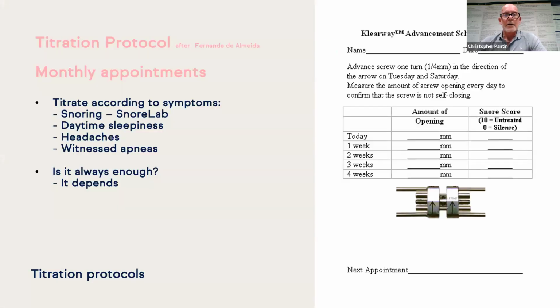All right. So this is looking at a titration protocol that was just put forward by Fernanda Almeida. She is a very, very important researcher in dental sleep medicine out of the University of British Columbia. Very sensible researcher, very practical research, not completely academic. It's very clinical as well. She's an orthodontist by training. So her approach is to do monthly appointments to ensure good outcomes for patients.